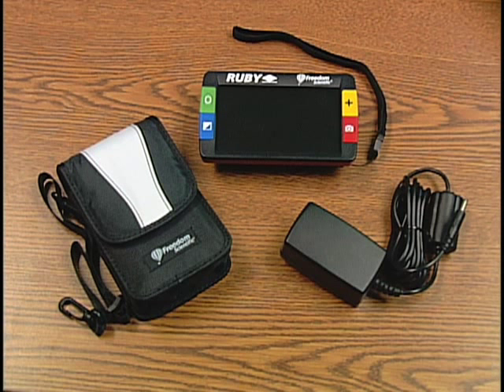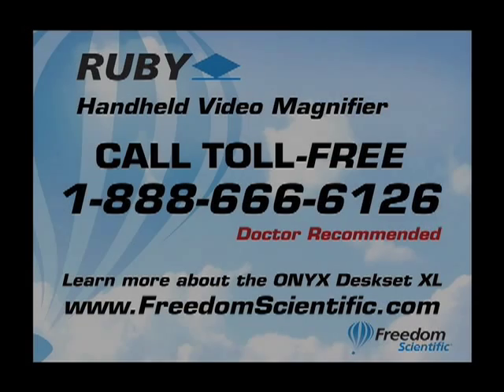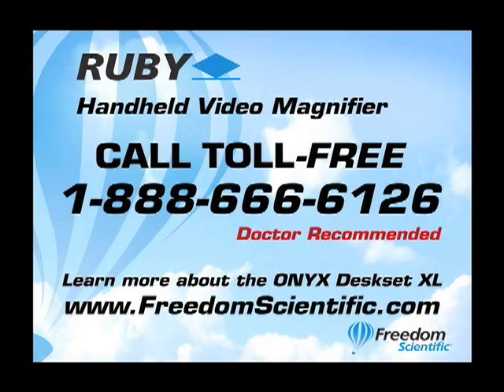The Ruby comes with a protective carrying case, so I can take it with me wherever I go. And that's what I do, because I've discovered that my Ruby helps me in hundreds of situations every single day.